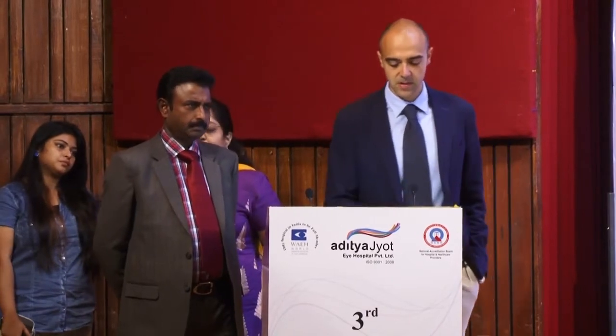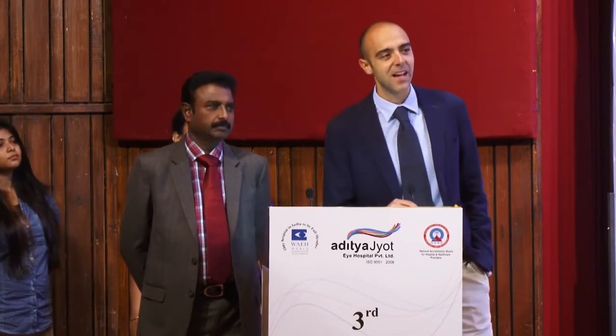Thank you. Dr. Mura, I have RP and I've been blind for the last 20 years. In case I have this Argus 2 implant done now, and in the near future a real treatment comes, say stem cells, can this be removed and that therapy done? Yes. Look, this is a question a lot of people ask me, because they say, if I don't have the surgery now, maybe in 10 years there's a better device or something new. The device has been explanted already in several patients. So it is possible to remove it, with no damage for the patient.